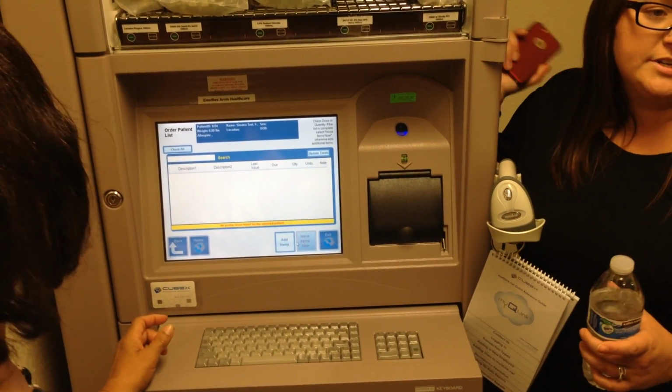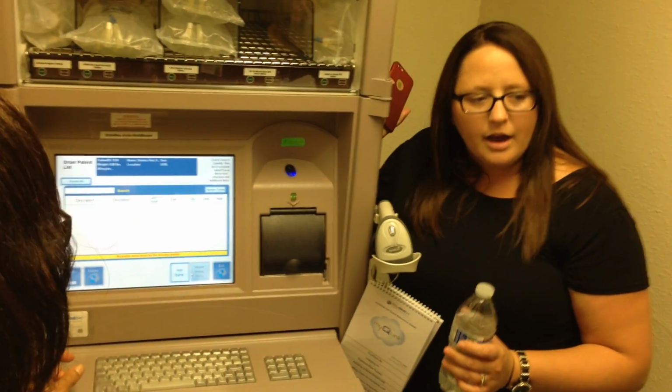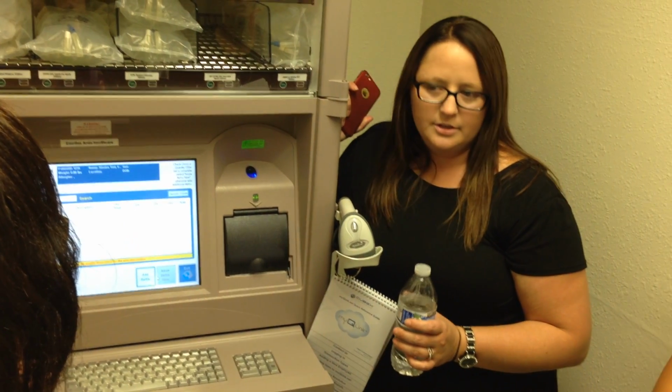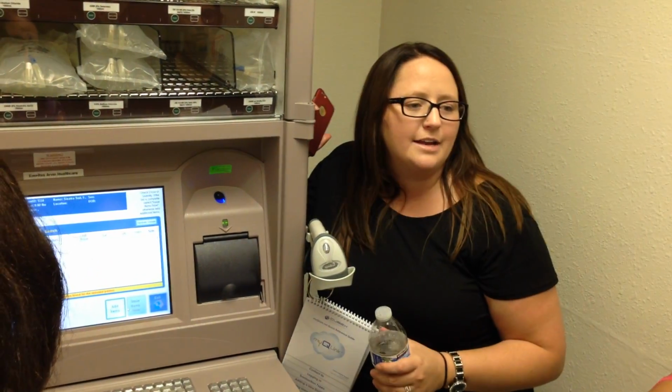Okay, so Frank Sinatra doesn't have anything on here because he's a test patient, right? For non-controlled items, supplies, anything up here, you guys can go ahead and grab those items out, okay? This is going to be the same. There are going to be certain people that have permissions to grab controlled items out.